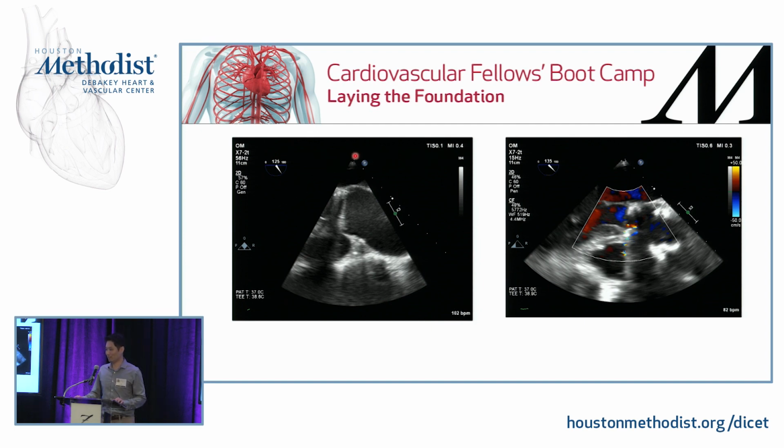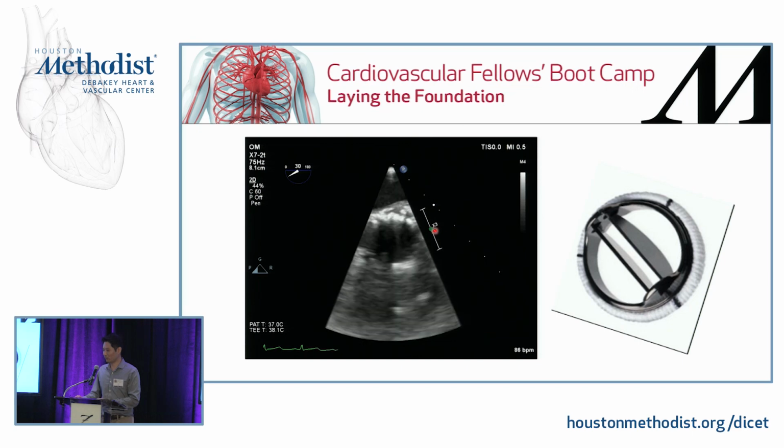This is the mid-esophageal long axis view in 125 degrees. And we put color on, color off, and looked okay. It didn't look like there was any paravalvular leaks that were pathologic. The valve leaflets looked like they were moving okay in the short axis, so that looked okay. We didn't see any masses or anything like that. That looked abnormal.